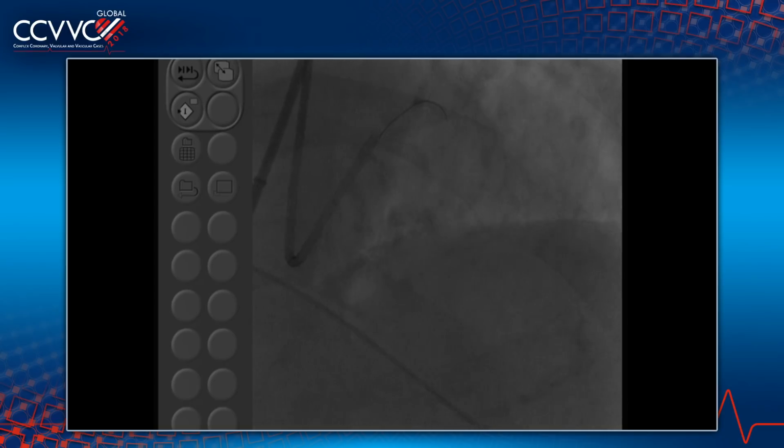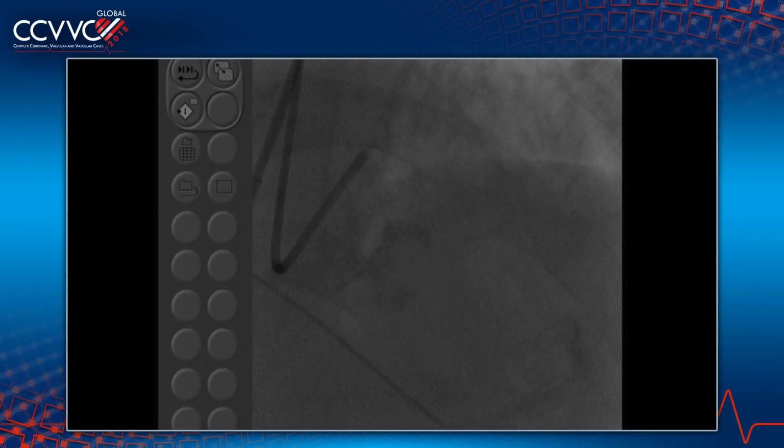Can you tell us about the true flow balloon, Dr. La Sala? Basically, it is concentrically aligned balloons so that the central portion is open. Particularly in people with low ejection fractions, or those you don't want to pace, you can blow up the balloon and leave it up for seconds or minutes, and you still have enough flow going through the center to avoid hemodynamic consequences. To your point, doing an obstructed balloon valvuloplasty in a patient with this kind of disease is worrisome if you don't have flow. That's the point.